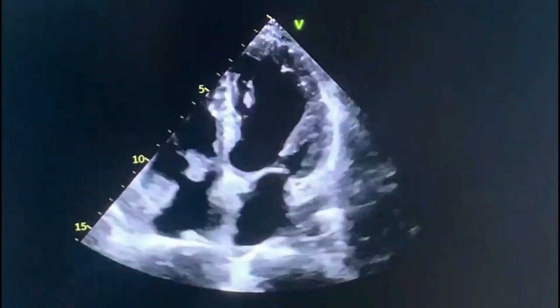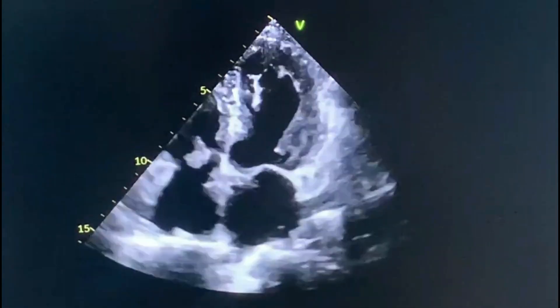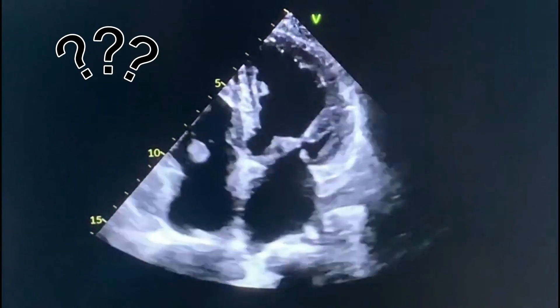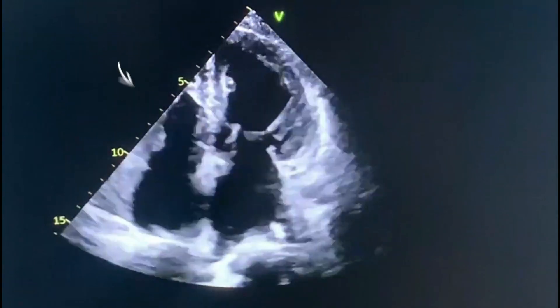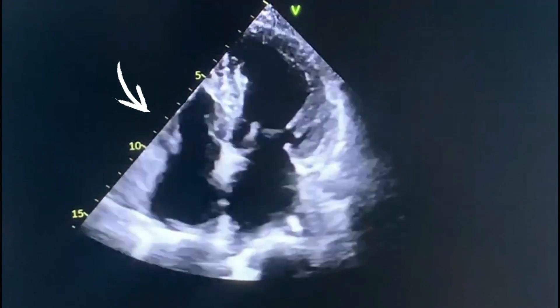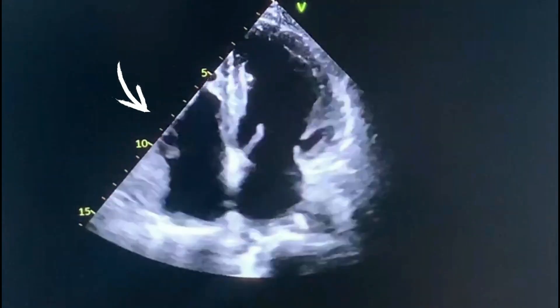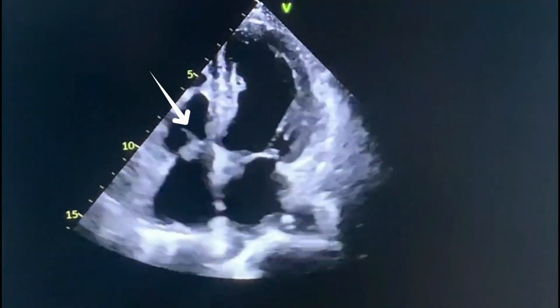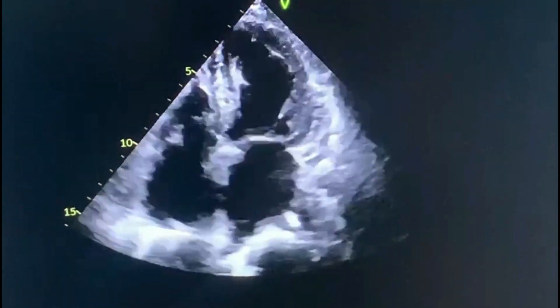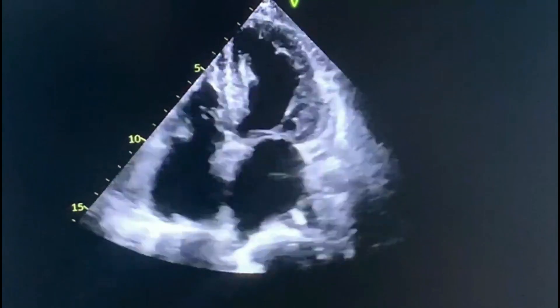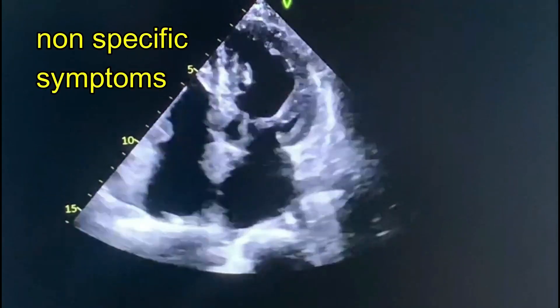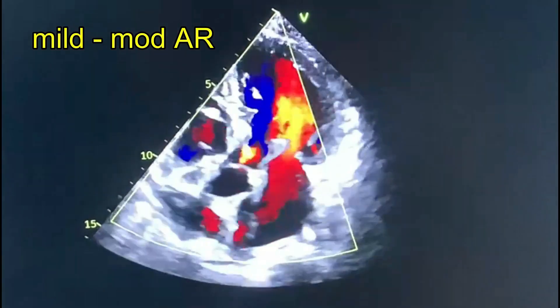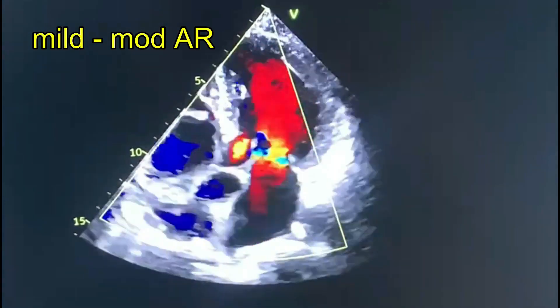A 75-year-old lady on evaluation for non-specific symptoms was found to have a mass on the anterior tricuspid leaflet, less than 1.5 centimeters, moving with the anterior tricuspid leaflet and not causing any symptoms. There is no tricuspid regurgitation, no tricuspid stenosis, and the patient had no fever or any symptoms for that matter.